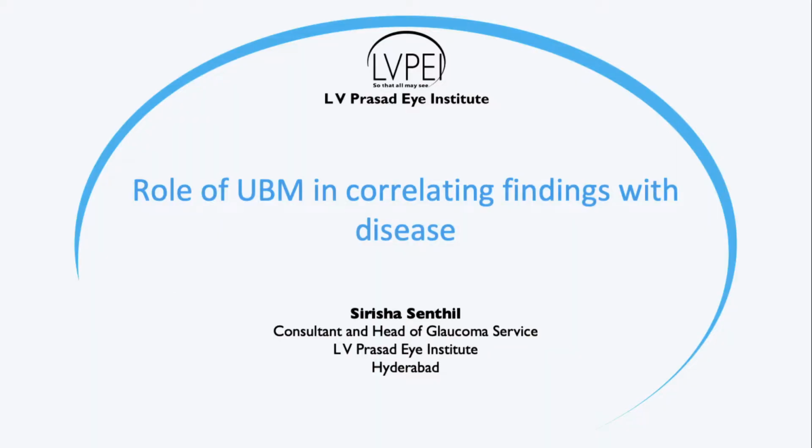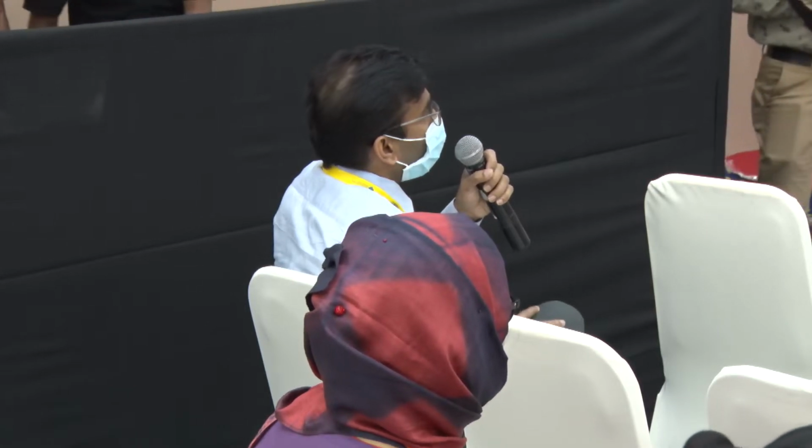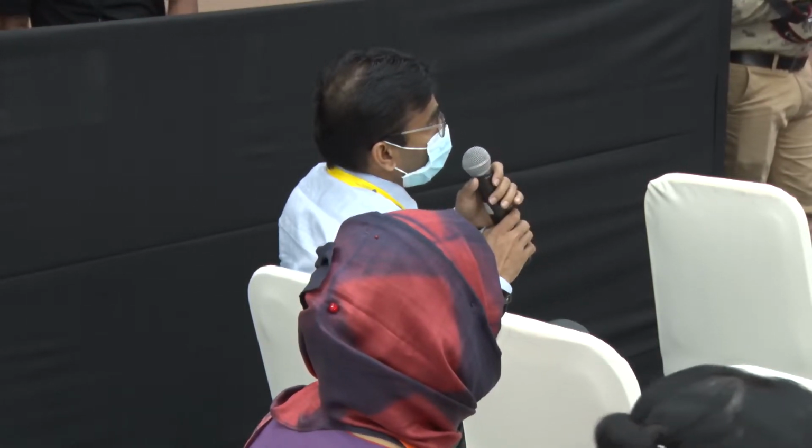I think if you have any patient with opaque cornea, we actually don't know what the anatomic structural detail is within the eye and anterior segment, because there can be ectropion uvea. What about the iris insertion level? That's also important for planning. If the iris is severely diseased, then goniotomy may not work for that patient, and more invasive surgeries may be needed. Because they all look the same, but the management could change with what they have.